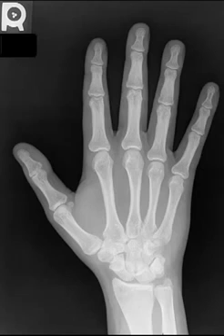Beginning in the wrist, this is the ulna. I'm just going to change my color here. I don't know how well black is going to show up. Here is the ulnar styloid. This is this stylus-like region, and again the rest of the ulna.